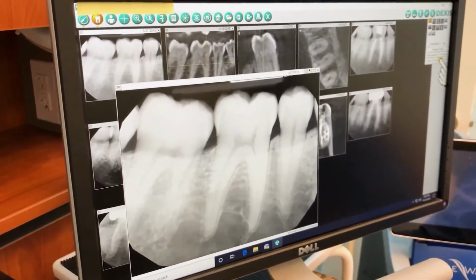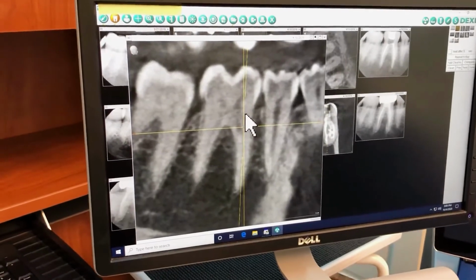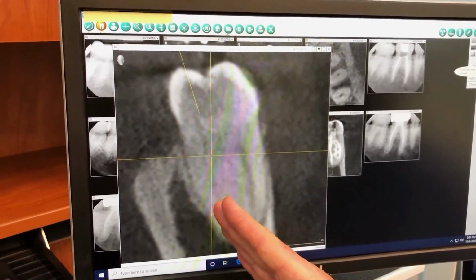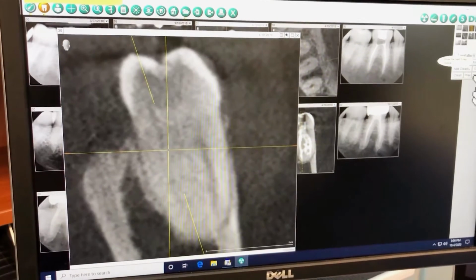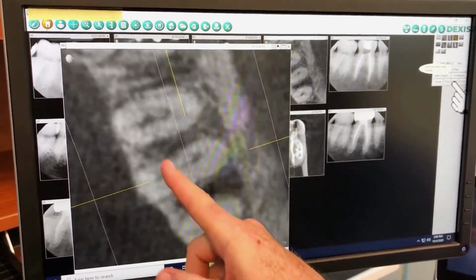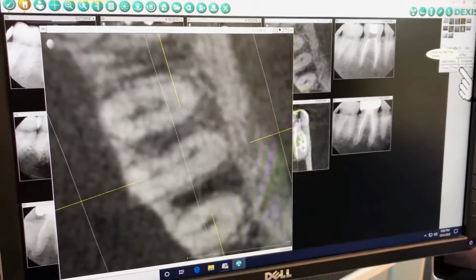So we opened it. First we always do a CBCT, or three-dimensional X-ray of the tooth. This is what that looks like, and you can see that this looks slightly different from the two-dimensional X-ray, but very, very similar. We also can now look at the tooth sideways. Now, sideways is an X-ray that we can never take. This is strictly from the CT, or in dental terms, the CBCT. Think of it like a computer tomography. And here it is also a little slice from the top part of the tooth, looking down just below the crown level. So you can see the front root here, you can see the back root here. Notice between these two canals, there is what's called an isthmus, or a little dark area, where we can see there's something in there, but what is it?